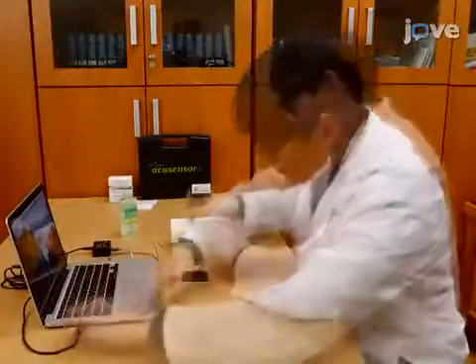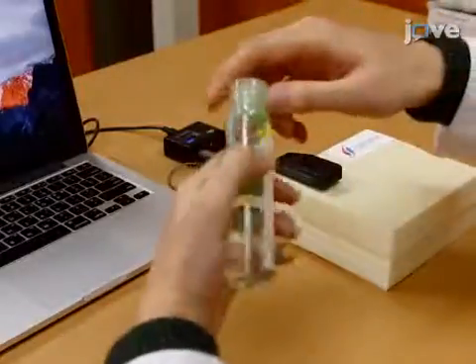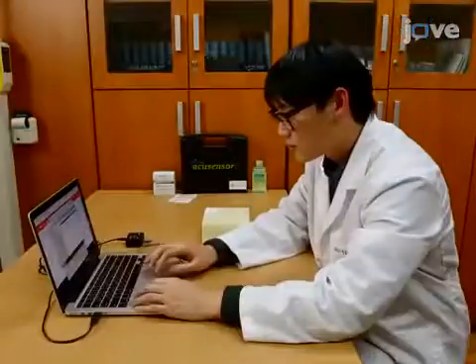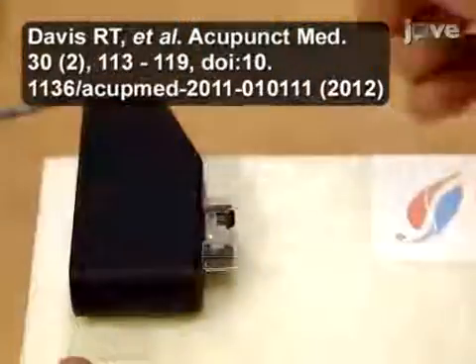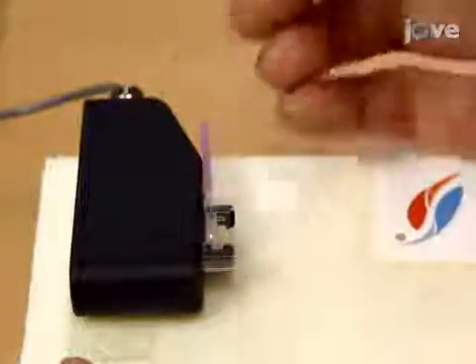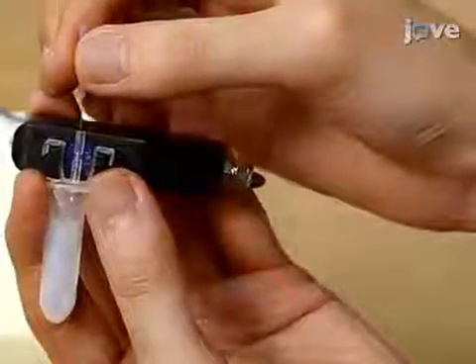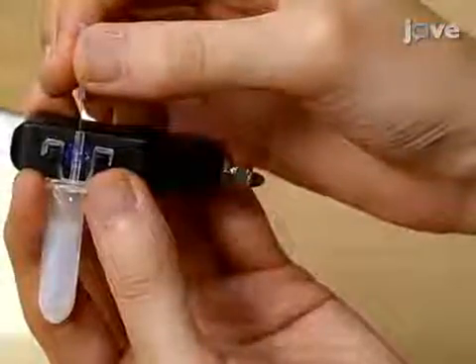After preparing a 5% agarose gel phantom acupoint and sanitizing hands according to the text protocol, download and install the program shown here. After opening the program, prepare the motion sensor. Position an acupuncture needle through the hole located at the center of the sensor. Because the acupuncture needle is not attached to the sensor, be prepared to move the needle through the hole while the sensor measures the motion of the needle. Prepare the phantom acupoint to insert the needle.